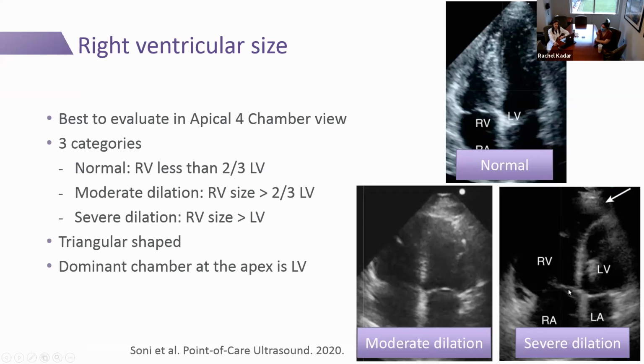Ways that you can tell is that the septal leaflet of the tricuspid valve is going to be higher than the septal leaflet of the mitral valve. So that confirms that this is the tricuspid valve and that this is the right ventricle. In addition, in the right ventricle, you'll have the moderator band, which sometimes you can see going across. So if you weren't the one taking your own images, sometimes those are two tips that can help you feel confident that the probe is not swapped.